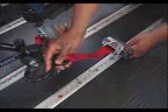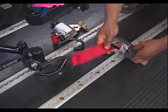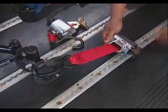Next, attach the S-hook to a structural member of the wheelchair. Then push the button on the retractor to remove the slack and crank it down for extra tension. Repeat this process for the other front strap.